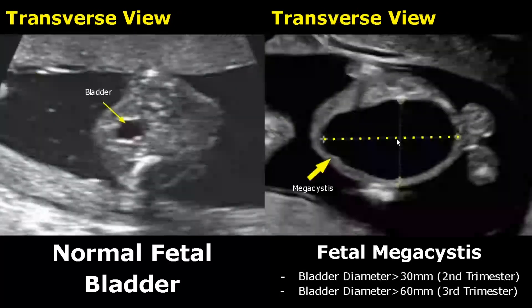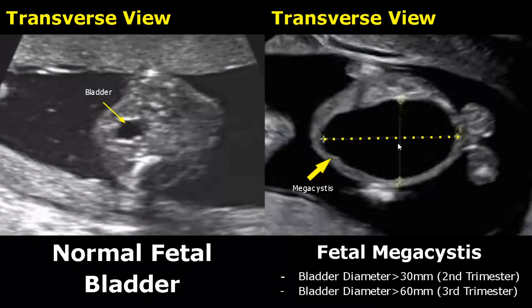Here we have a transverse view showing fetal megacystis. In the second trimester, the bladder diameter will exceed 30 millimeters in the case of megacystis, and in the third trimester it will exceed 60 millimeters.